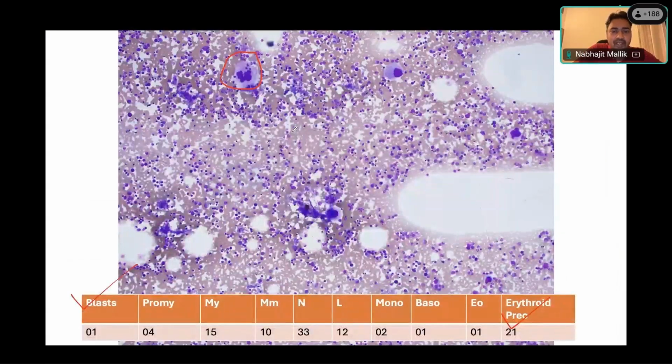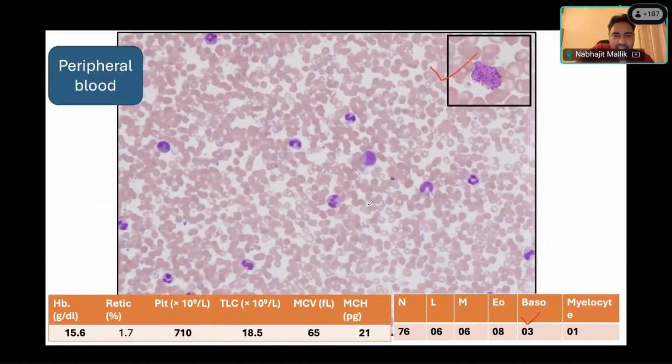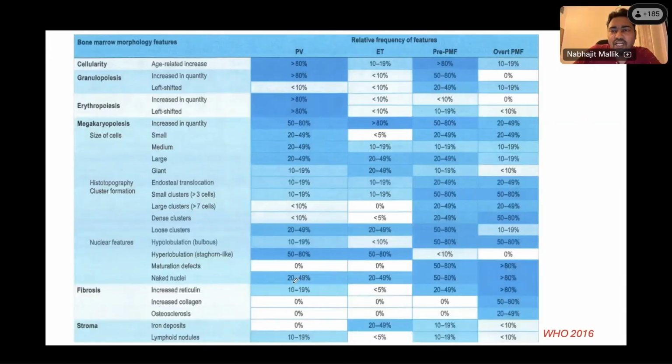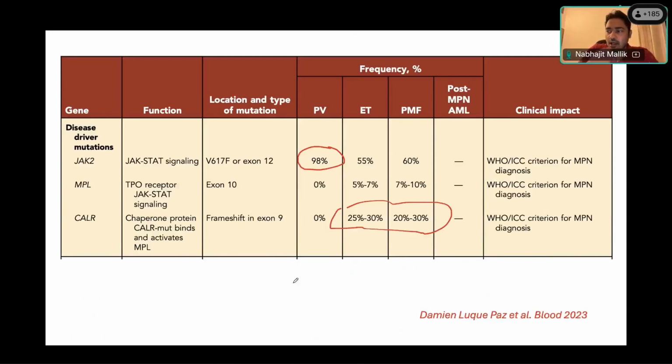If you go back to the bone marrow and peripheral blood, can you look at the MCV and the MCH here? How much is it? The MCV is low. Yes. What about MCH? MCV and MCH are both low. Right. So now could you think of an explanation here? What are the conditions in which your MCV and MCH will be low? Most common, iron deficiency. Wonderful, iron deficiency, right?